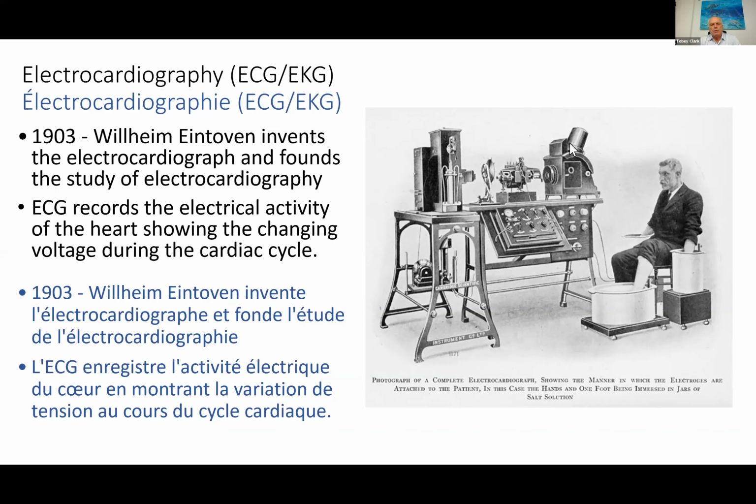I'm not sure if you mentioned this, but just to explain the photograph here or the drawing, you can see this is Dr. Einthoven, and he has his arms in buckets. Those buckets are filled with saline, salty water, and he also has his leg in that bucket.